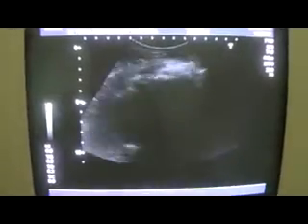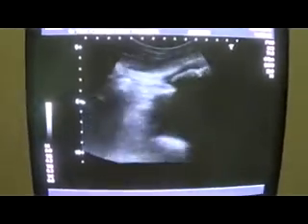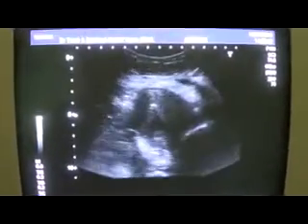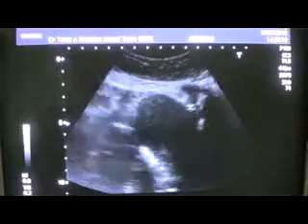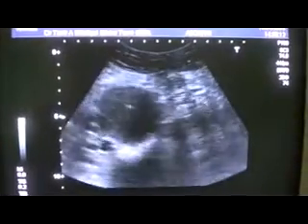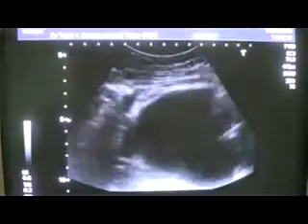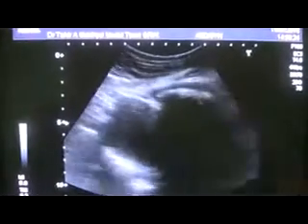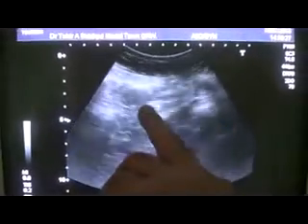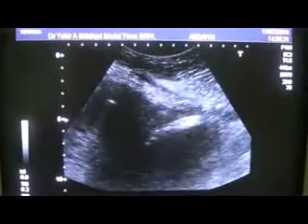And from here we see a band of echogenic band lifting the uterus upwards. This is the transverse section of the uterus. There is no fluid around, and this is the urinary bladder. Again, to repeat it, the foreign body, the uterus, which is elevated by this band.